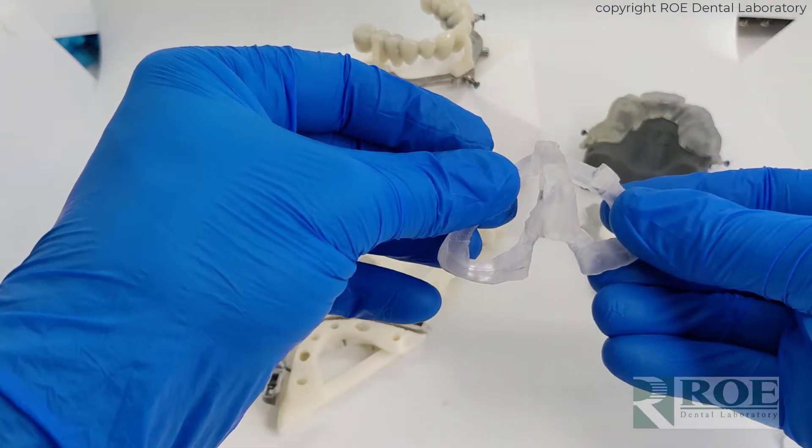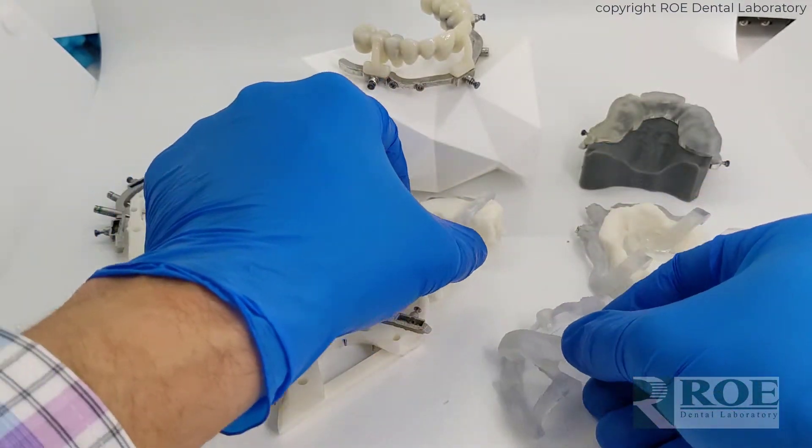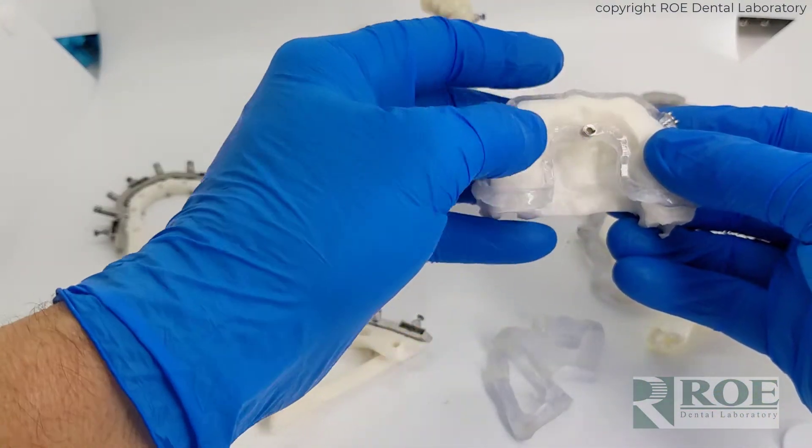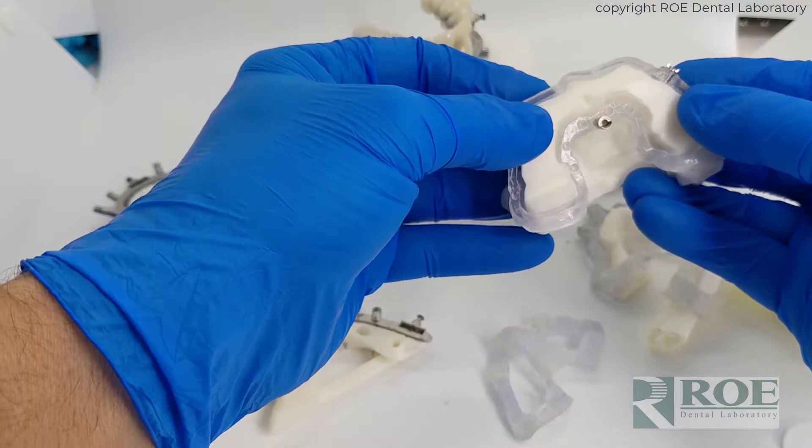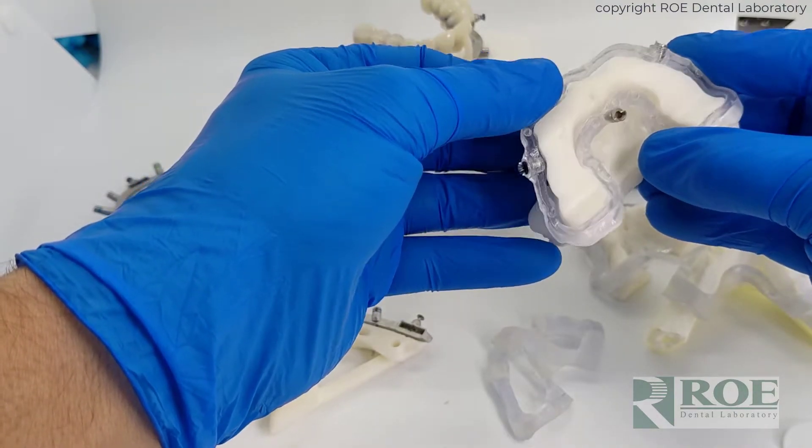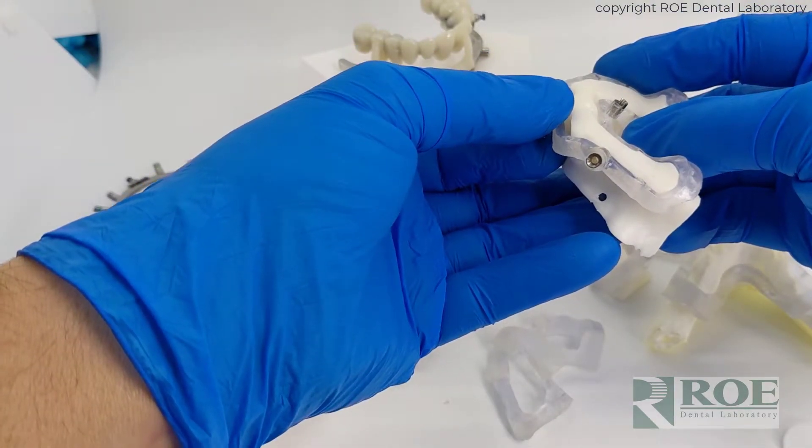You'll see that repeated on different designs. Prior to chrome, we made plastic guides and then developed the chrome cobalt system and then moved away from plastic altogether.